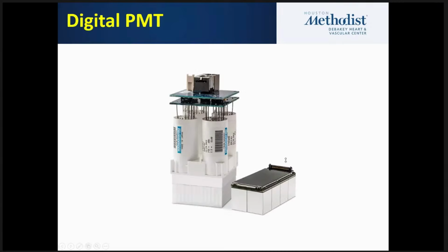Now, using this digital system, we are able to routinely do these studies at even lower doses. So PET is already a low radiation dose procedure, but now we have lowered it significantly, and we can use our generator for a longer time, within that 7 week non-expiry period.